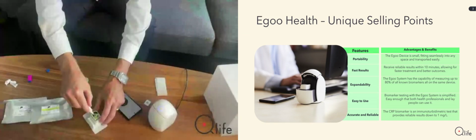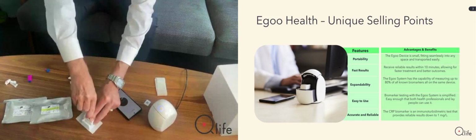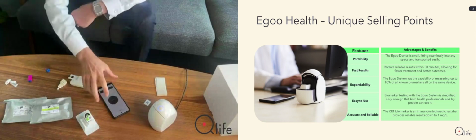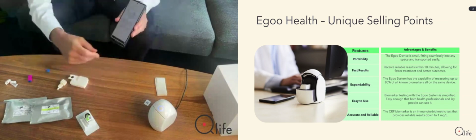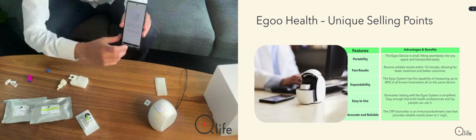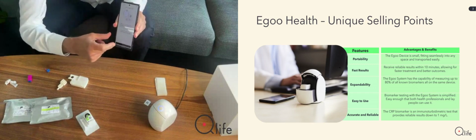And then you enter it into the capsule. You need to stick it nicely down so that it says click, pull it up, and now it's gone. And then you go into the Egoo collect. You hit the, I don't know if people can see, in front of the camera. Yeah. Maybe you can see here. Yes. And then it basically guides you through the different things that you should do. But essentially, it's ready now.